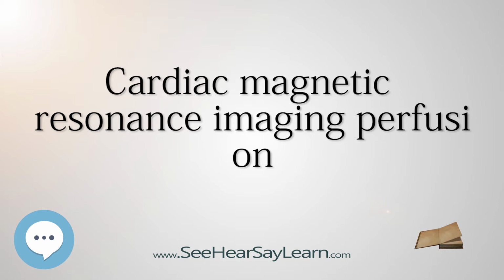Safety. It is a non-invasive test and is generally regarded as safe. However, there are some patients for whom this is contraindicated, and there are a number of potential complications. Contraindications. Any patient who has a contraindication to MRI scanning, especially those with pacemakers, see MRIsafety.com. Patients with severe asthma, as adenosine may provoke an attack.